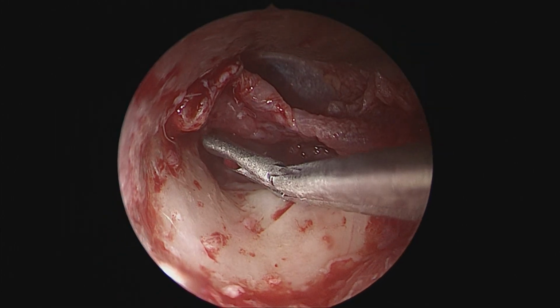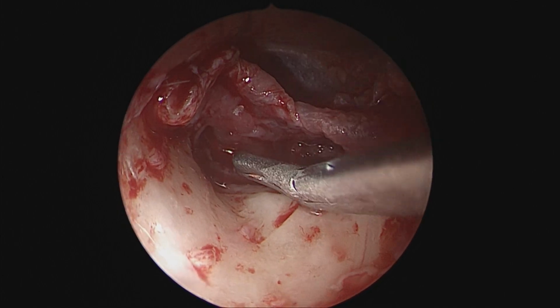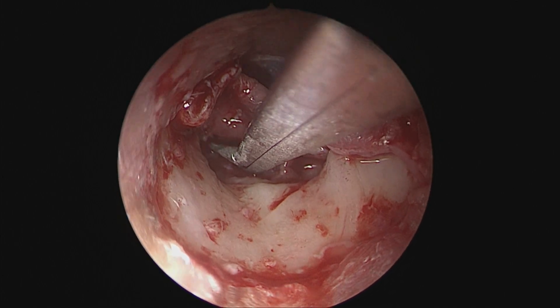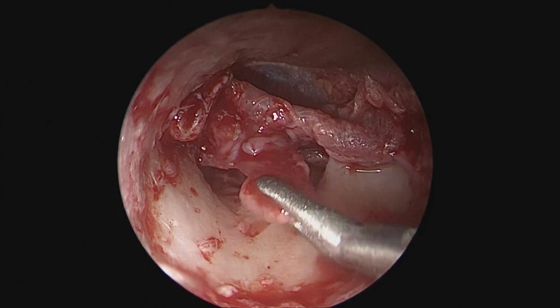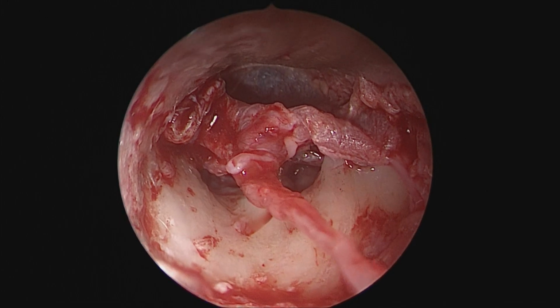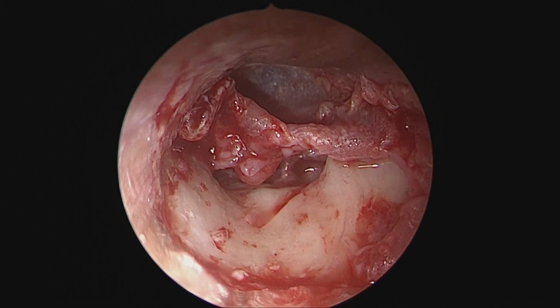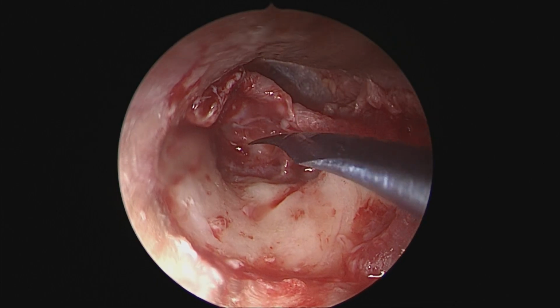Now we are taking an angular cup forceps to just clear some more mucosa from the posterior inferior region, the diseased mucosa, so that we can see the healthy epithelium. And all this excess mucosa that we are removing will be sent in divided portions for culture as well as histopathology.